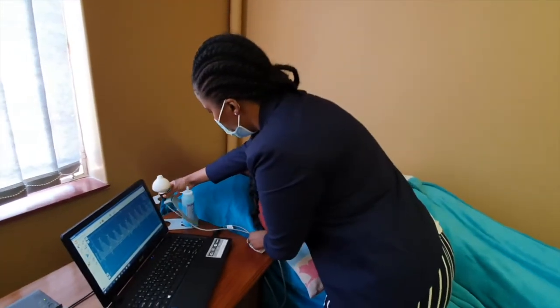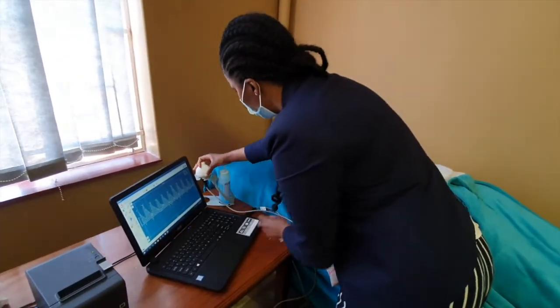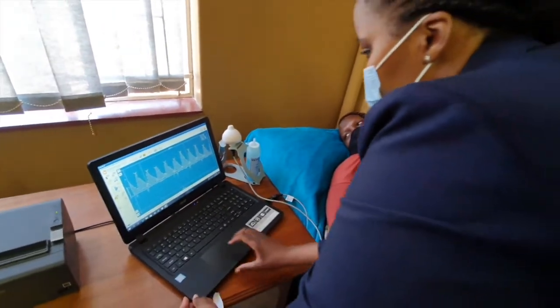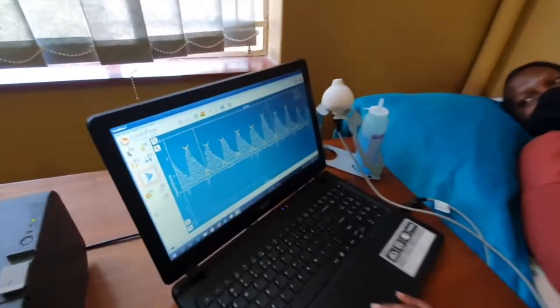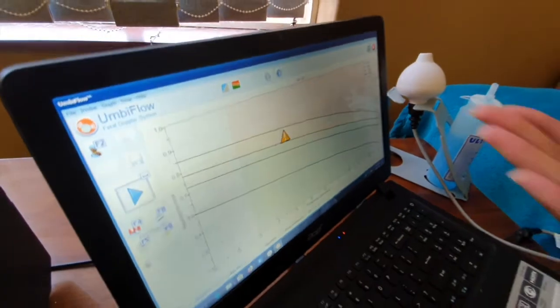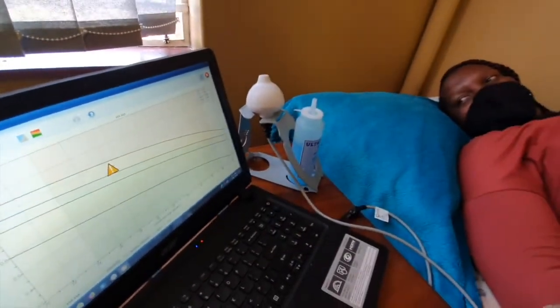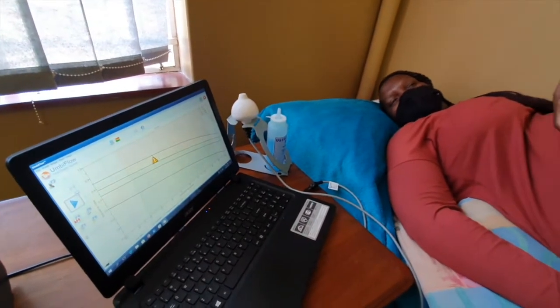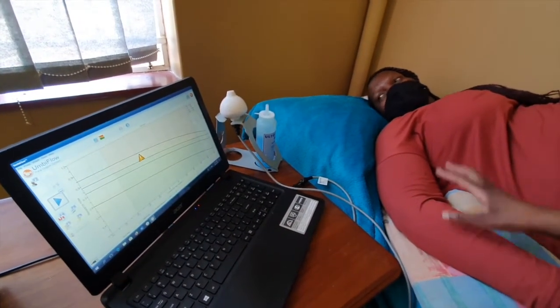This was the audible fetal umbilical artery signal. The software then automatically plots the RI against the gestational age of the woman, and this graph is shown to the woman. This woman's RI of 0.73 is just above the 75th centile for her gestational age of 28 weeks.